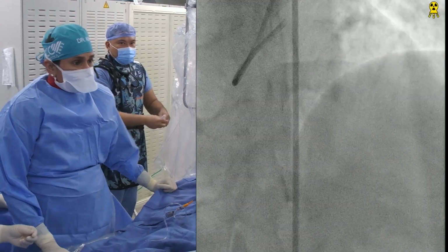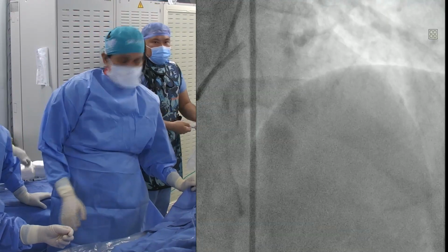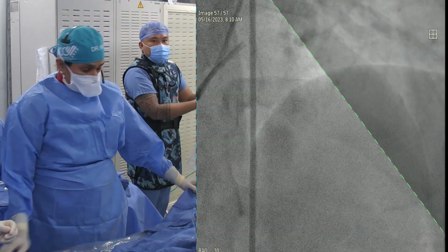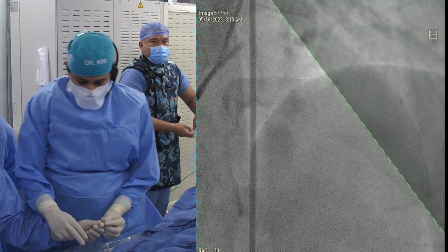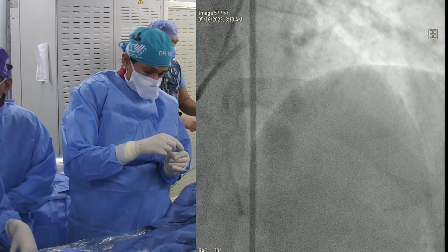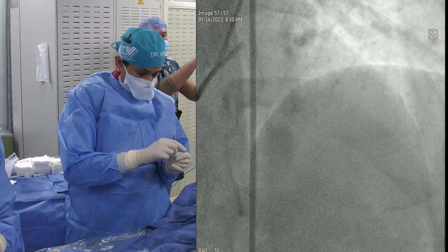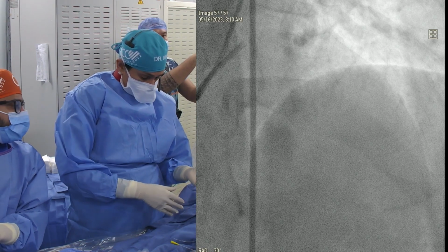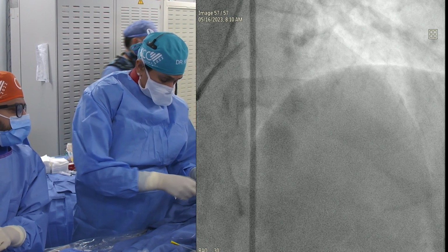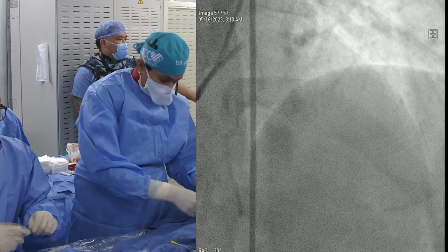I know you mentioned imaging, but you would not want to image in the end. Many times, to me, imaging basically means, unless proven otherwise, it's in the end. A lot of people decide based on the imaging. I would say imaging is the ultimate frontier that you make your stent apposition, expansion, and avoid any dissection. So therefore, from my point of view, the imaging in the end is the most important. Otherwise, we decide based on the angiogram.